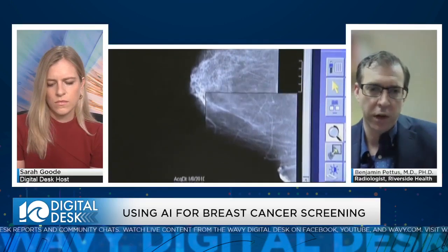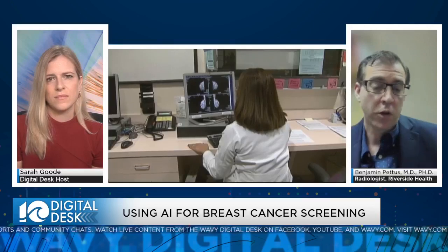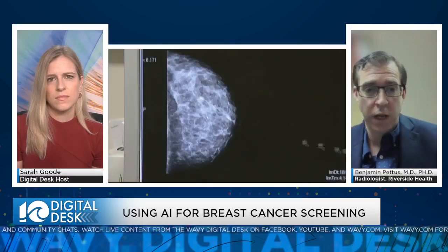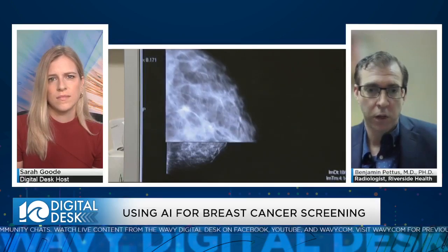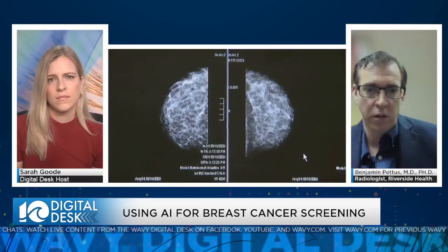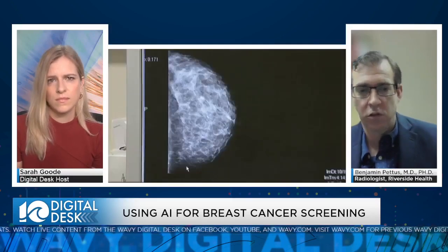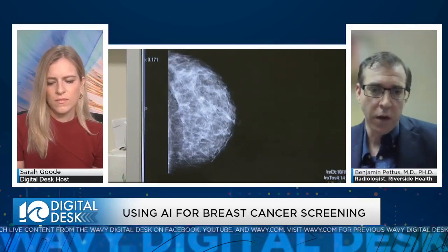The computer is not going to get tired like a human might in terms of going through all those images. So there still are cases that we're finding cancer and the AI is not. So it's certainly not ready to be just unleashed to make decisions. And like I said, it's not designed to make the decision on its own. It's just a database of experience to flag an area that's questionable.